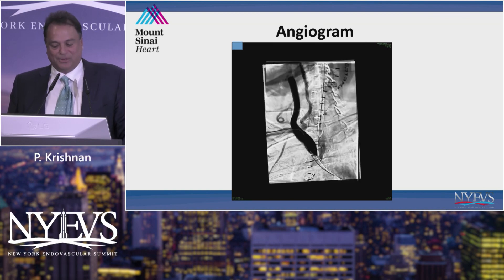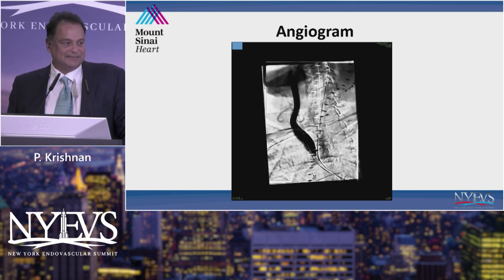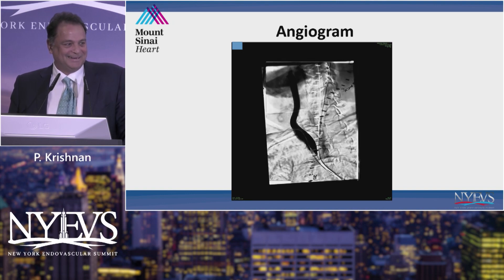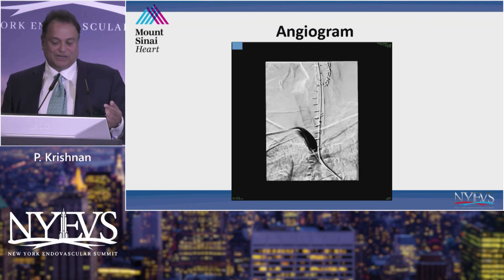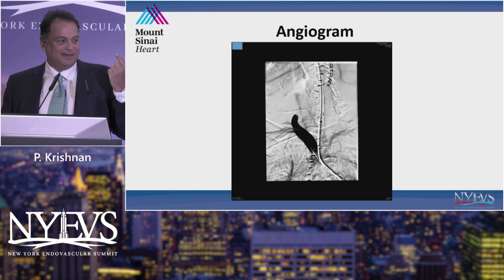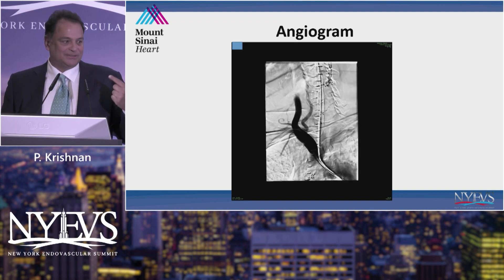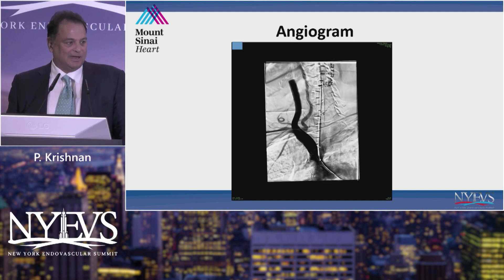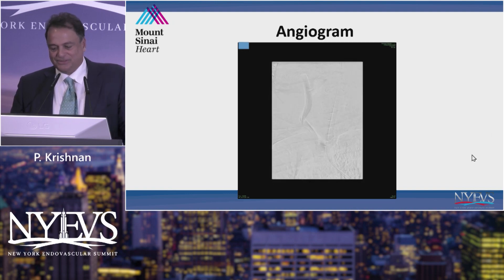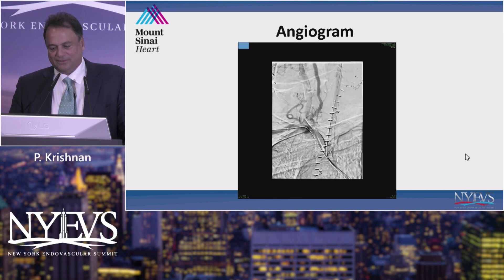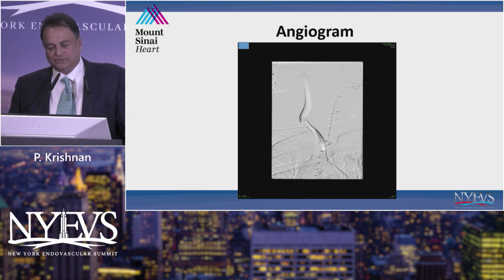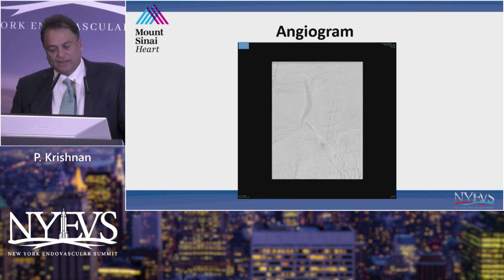So what would you guys do now? We have no flow in both. We have the stent in place on the other side. While we inject here, we dissect this carotid, and now she's becoming a little symptomatic, as you can see by her movement. We have access from both sides, but there's a dissection plane in the innominate tracking up the right. We have the stent in place on the right, so we said let's secure the left and then decide. With quick decision making, we went ahead and stented the left. And there is flow.